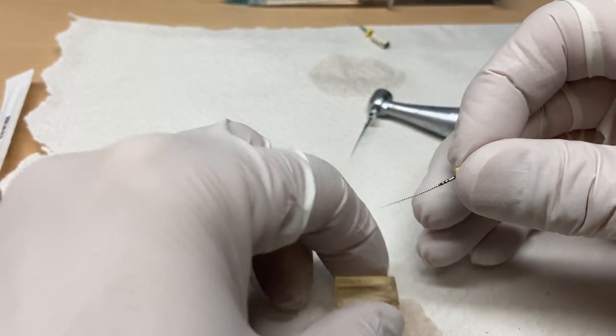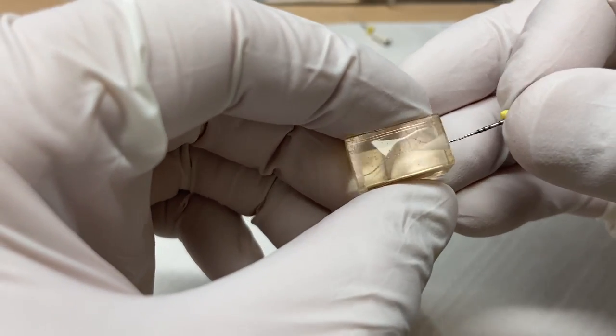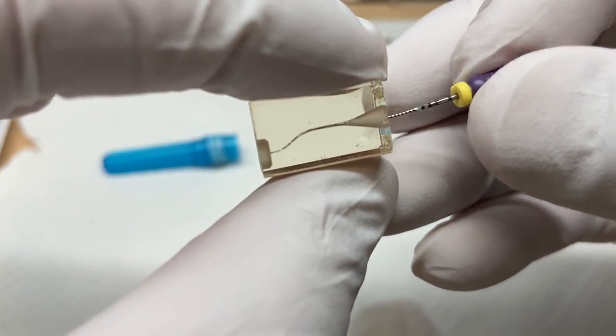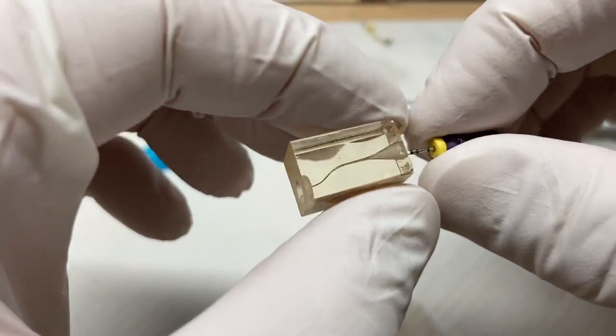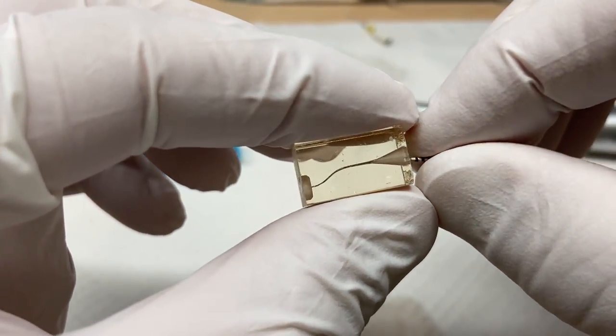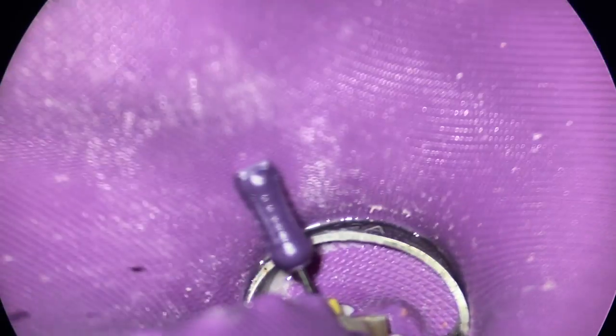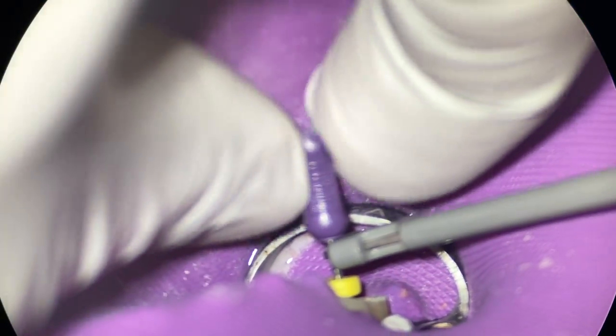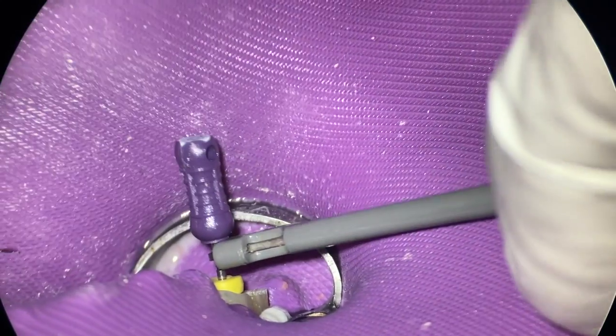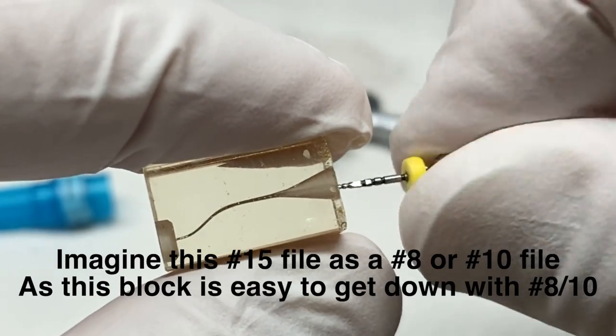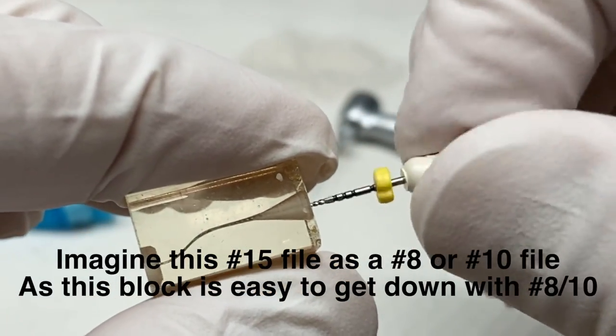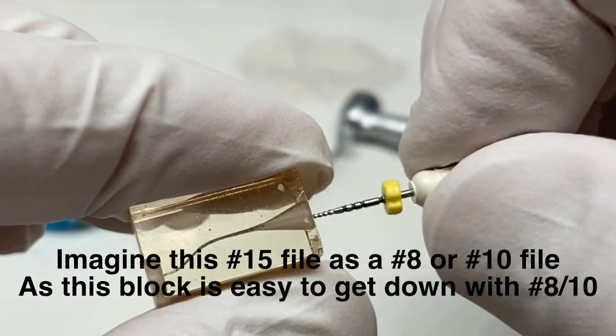And as we'll take your 10 file, and I'll try to do this with even larger files and see how more effective it is. Let's do some testing. So let's watch wind this down to length. Boom. Oh, this is pretty easy. So in a real case, like the case I'm going to show you, when I got my 10 file down to length, it was tight. Like it would not, it'd be watch wind, pull, watch wind, pull, watch wind, pull. So it's not as simple as this. Let's go ahead. Let's up the ante. So I'm going to use our 15 file. Now 15 file is a big jump from a 10 file. There we go. Watch wind, pull.